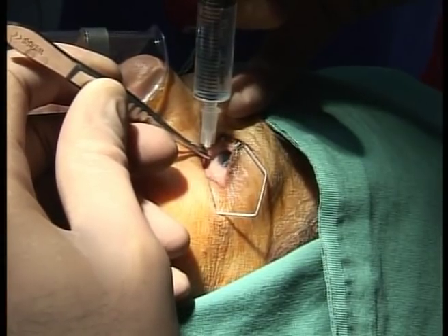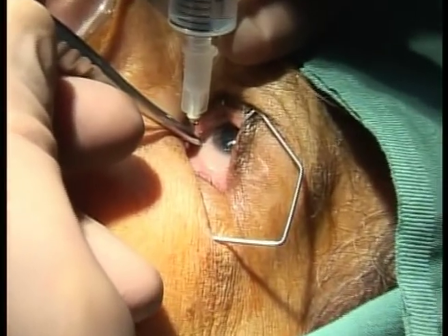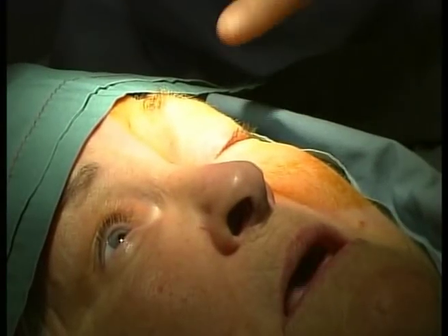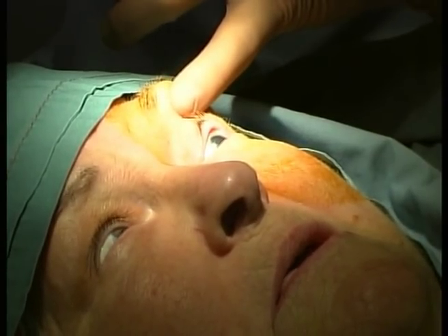And then all of a sudden, almost finished, Jennifer. The patient sometimes has some slight discomfort there. All of a sudden you get a loss of resistance and I'm able to inject. The onset of a Sub Tenons block is very quick, so you can move into theatre within a couple of minutes of performing the block, and the technique is quite suitable for a busy eye list.